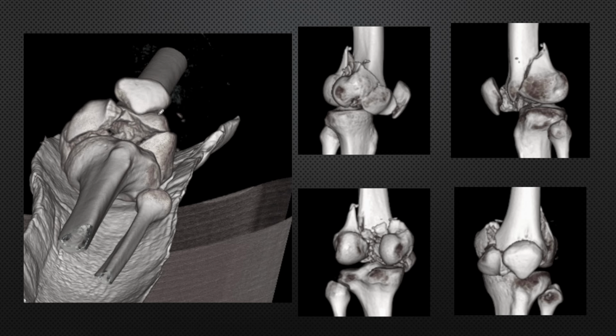This part is the trochlea, which is still intact and part of the proximal fragment, and this is the void that the fracture has created. And as we see from the sides, the medial condyle, here you see there is extensive comminution which we had seen in the other cuts. There is some comminution on the posterior part, but the good thing is that the posterior condyles are still intact. So whenever you are encountering these injuries, the posterior condyles are mostly intact. So they are good for your surgical planning.